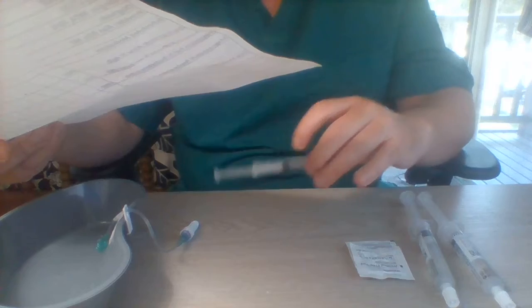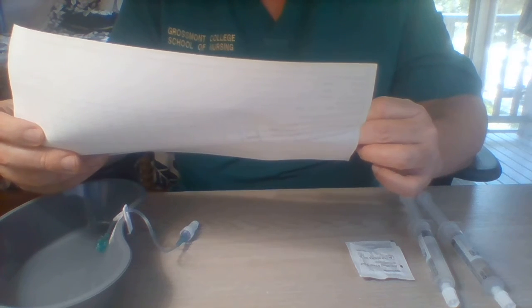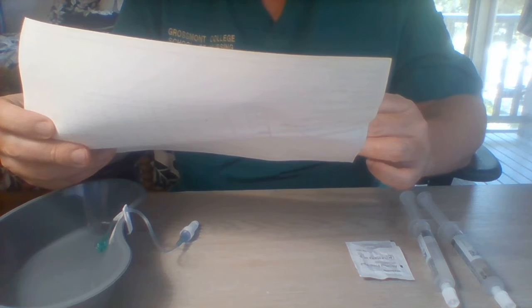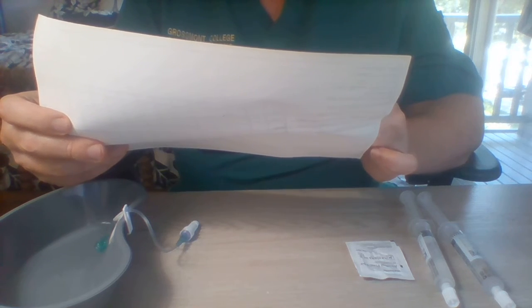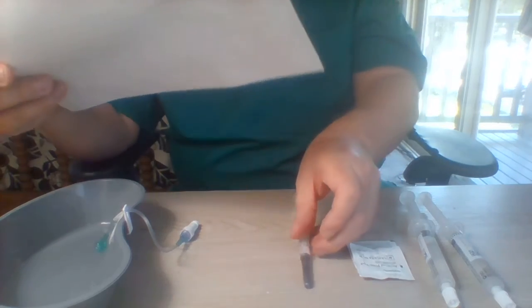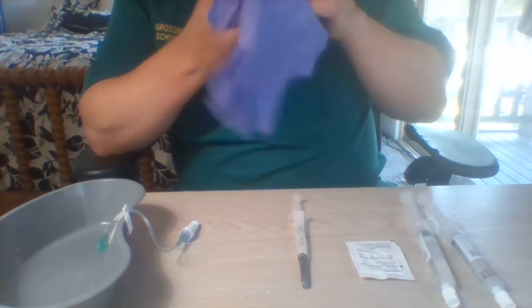Have the right patient, and now I'm ready to perform my third check in front of the patient, comparing the medication with the MAR, making sure it's the right medication, Zofran, right dose, 2 milliliters, right route, IV push, right time as needed, so now, and right reason due to nausea. I perform hand hygiene again and put on clean gloves.